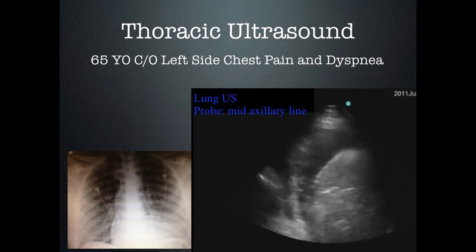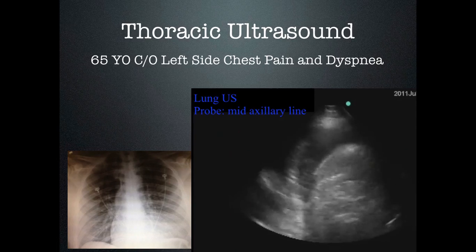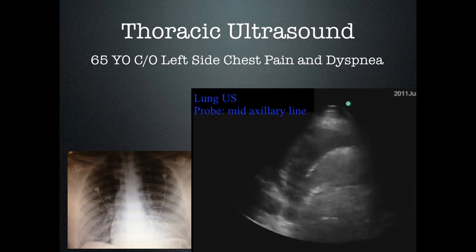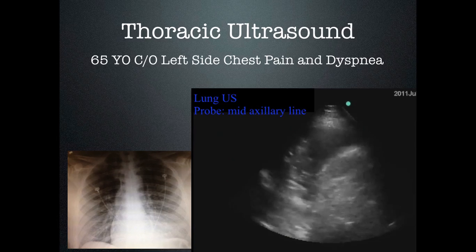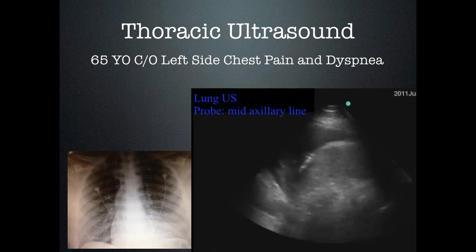Is this a symptom or a cause? Are they more short of breath because they have an increasing pleural effusion, or is this a parapneumonic effusion and is associated with the pneumonia? Well, we would look at the back and we would detect how big this is. If this is a small pleural effusion, then that is probably not the reason why they're getting more short of breath. So we keep looking.